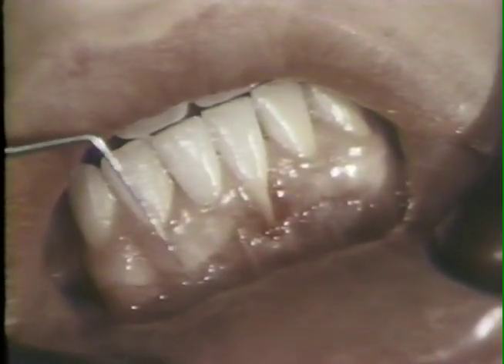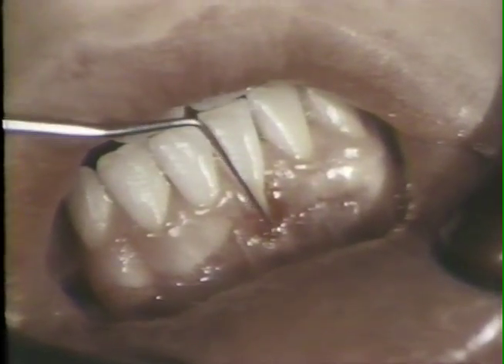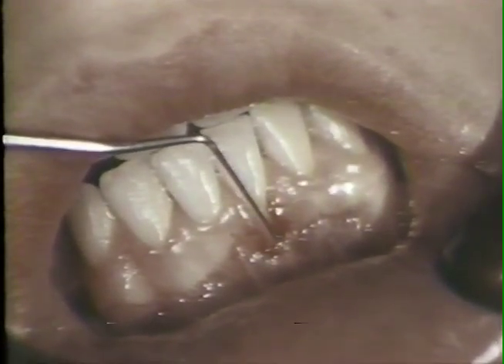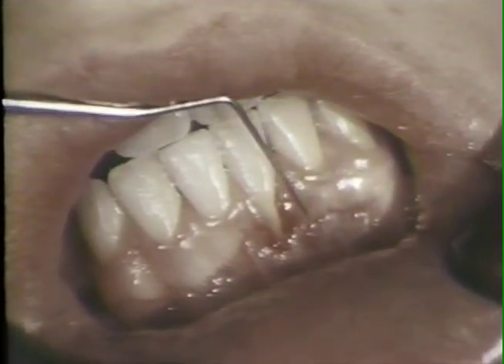This 16-year-old high school student is in excellent systemic health and has just completed orthodontic treatment. His chief complaint is recession and tenderness of the gums around the left lower central incisor. All lower incisors are in labial version following the orthodontic therapy, and the labial tissues covering the teeth are thin.